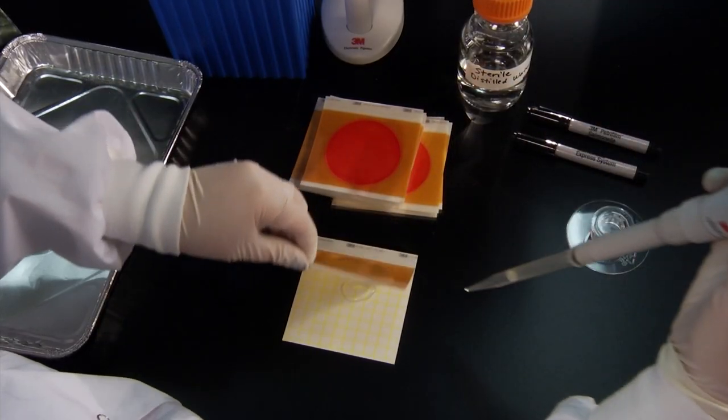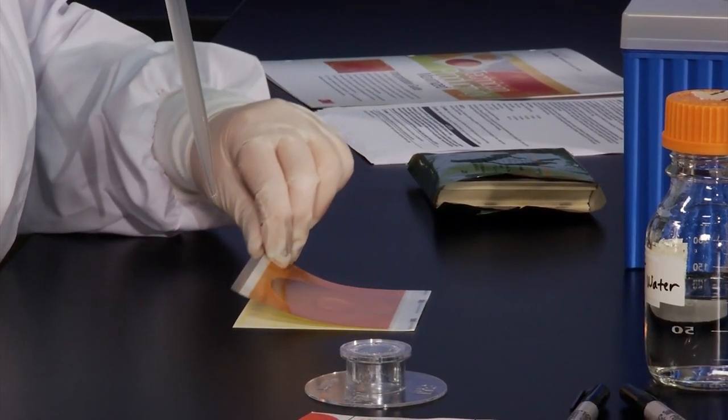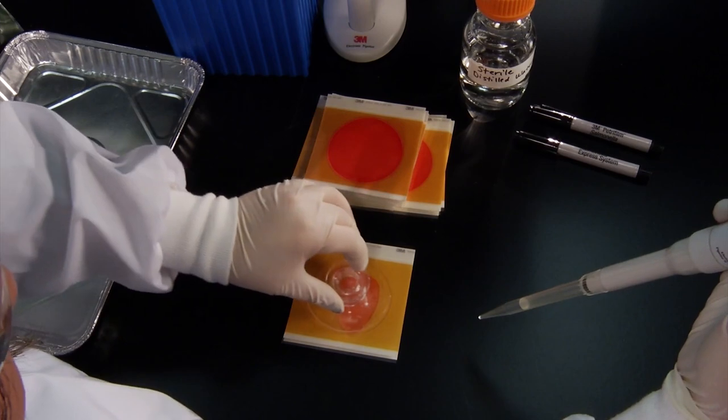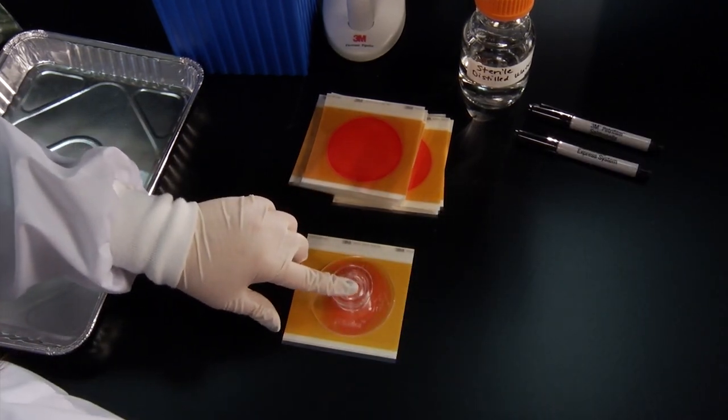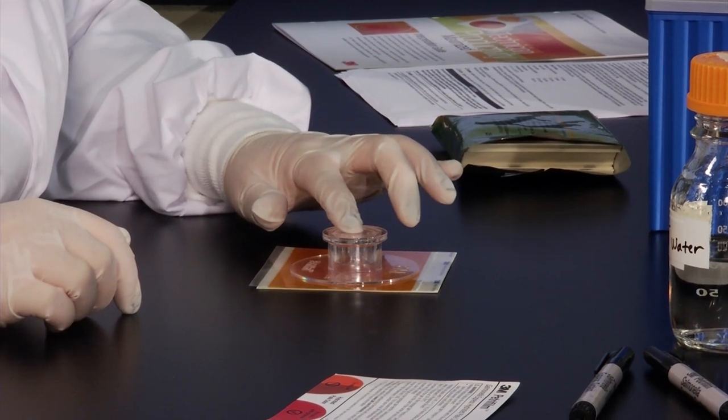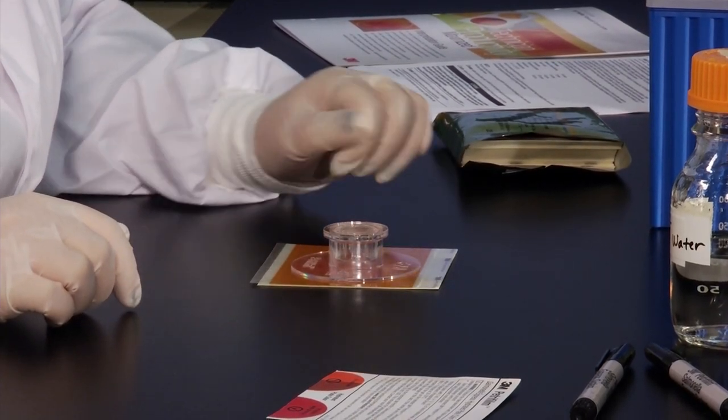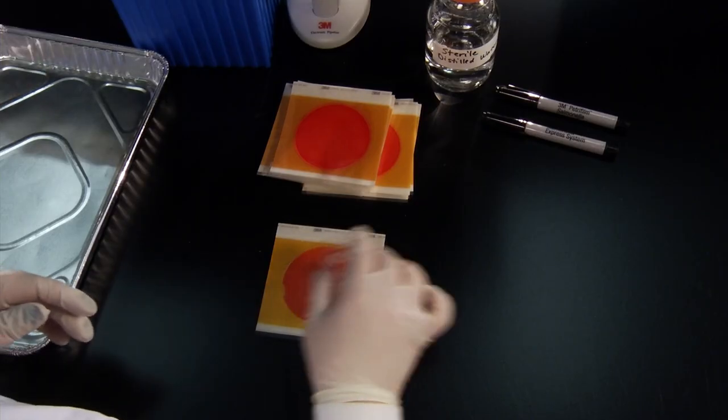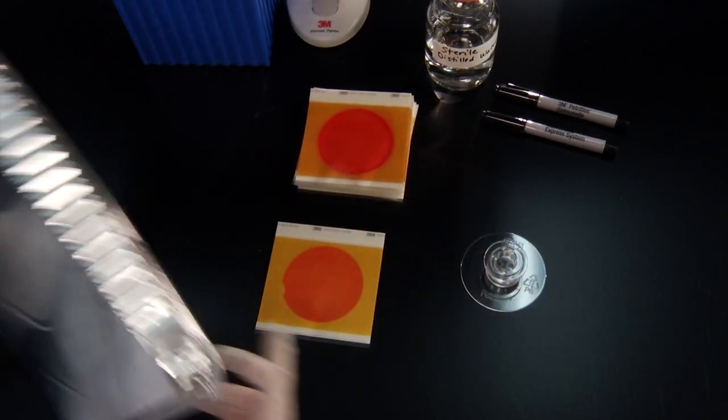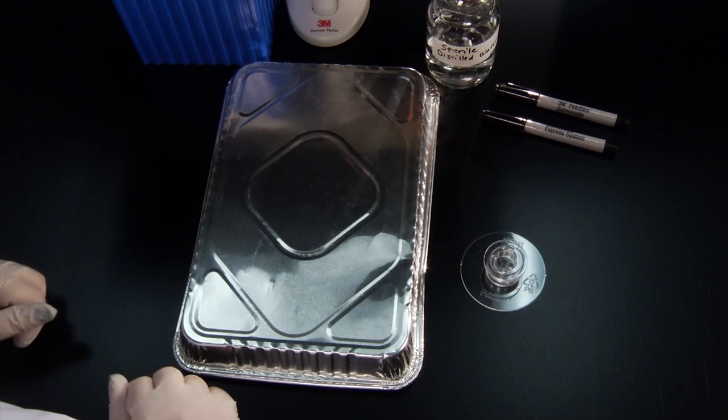Gently roll down the top film onto the diluent to prevent trapping air bubbles and place the 3M PetriFilm flat spreader on the center of the plate. Press gently on the center of the spreader to distribute the diluent evenly. Remove the spreader and leave the 3M PetriFilm Salmonella Express Plate undisturbed for at least 1 minute.